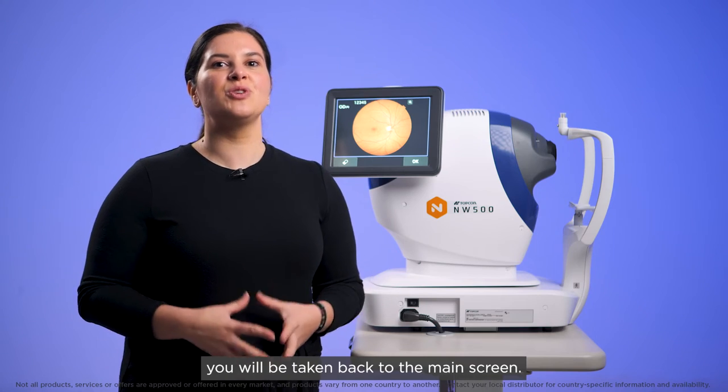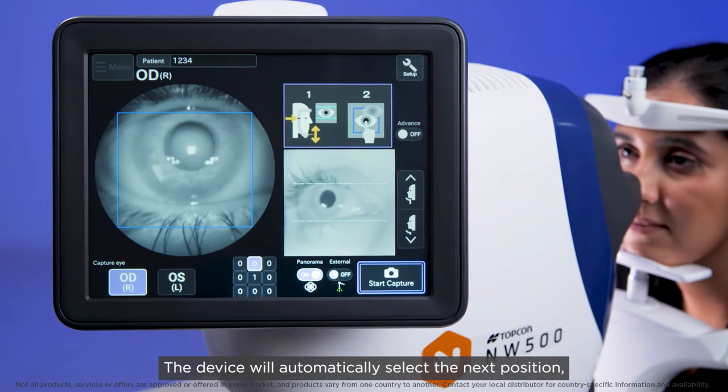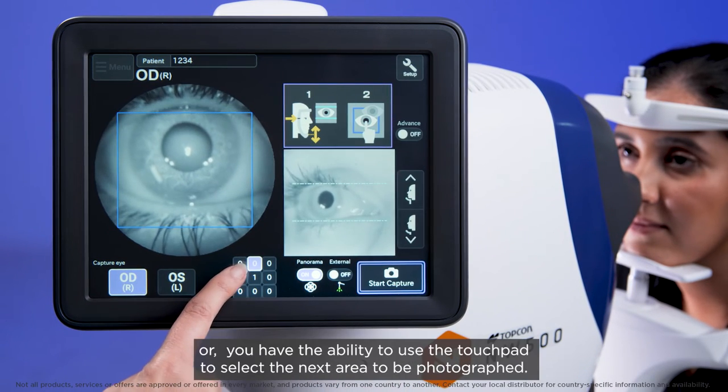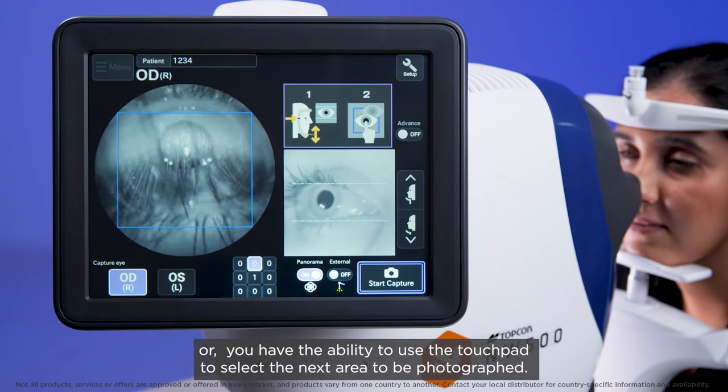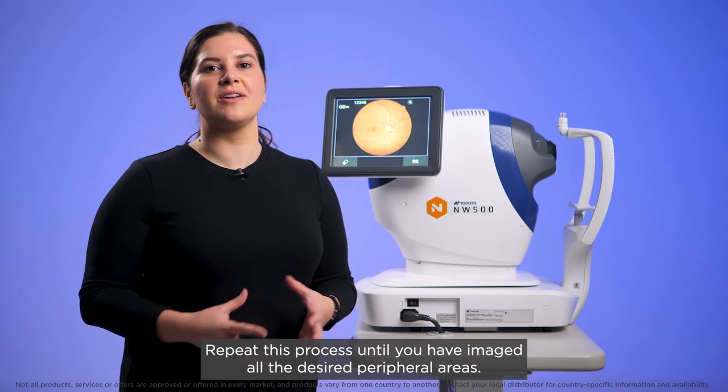Once you have saved the image, you will be taken back to the main screen. The device will automatically select the next position, or you have the ability to use the touchpad to select the next area to be photographed. Repeat this process until you have imaged all the desired peripheral areas.